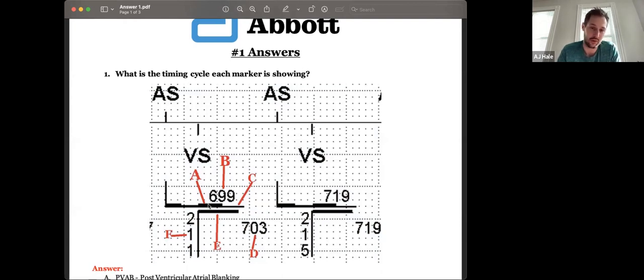And just for everyone who doesn't know, TARP is the total atrial refractory period, or the total time that the atrial channel is essentially blind. It sees an atrial event and completely blinds itself, so it doesn't have any kind of double counting in the atrium. Then it has a relative refractory period waiting for the ventricular event to occur. The ventricular event occurs, it reblanks, so we don't have any far field oversensing on the atrial channel. Once that ends, it goes into a relative refractory period of PVARP, which is trying to block out any kind of retrograde atrial event that could roll up.